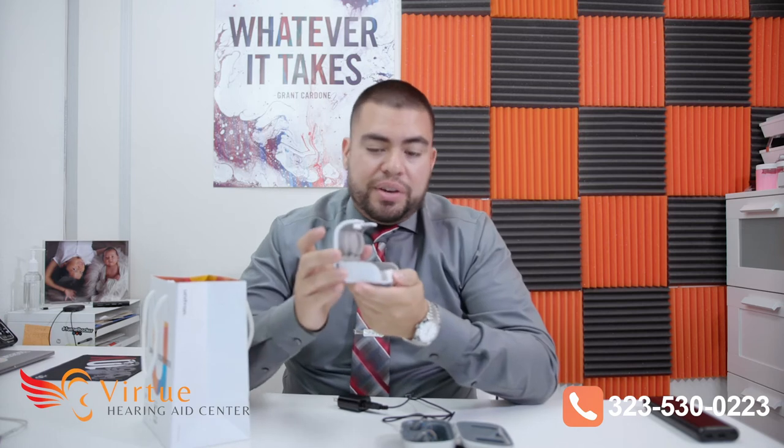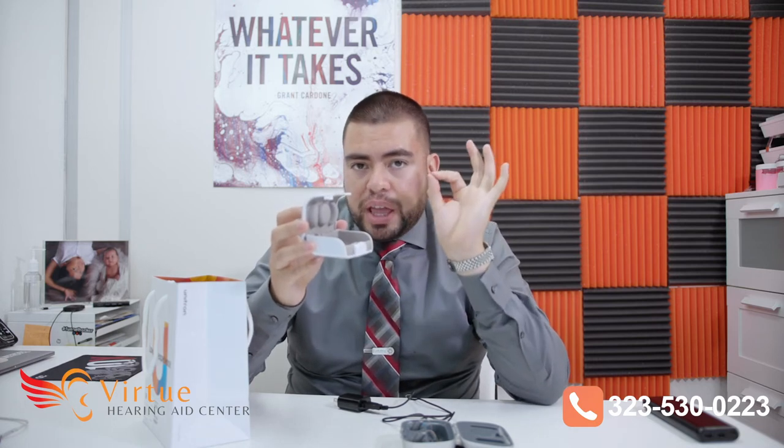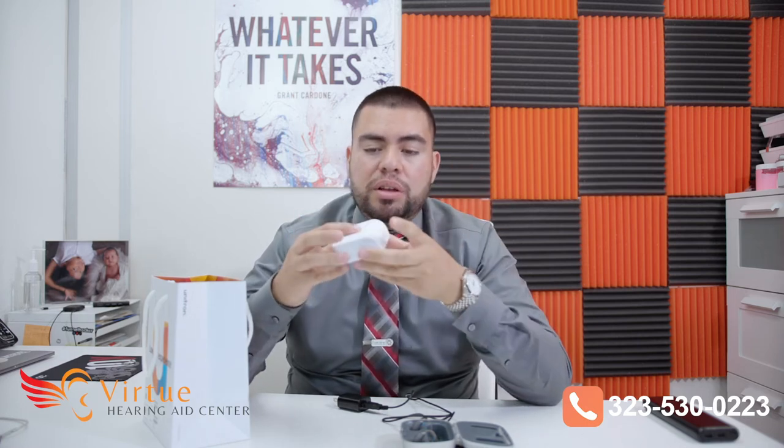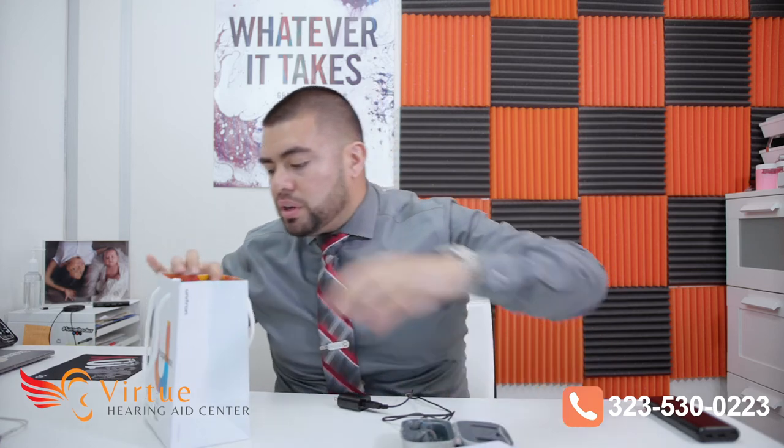It also comes with an extra carrying case. This case is for when you're out and about and you just want to take a break — you can take the hearing aids off. The hearing aids have a button that you press to completely shut them off. You put them in here. It comes with a separate brush to clean them as well. You also get a third case that has a zipper on it, and you can put the hearing aids in there along with some extra accessories in the little pocket and zip them up.